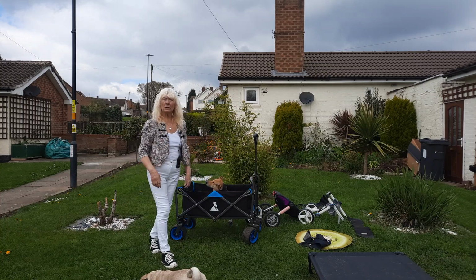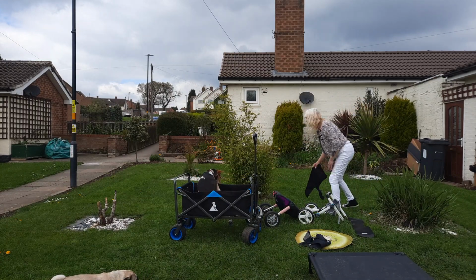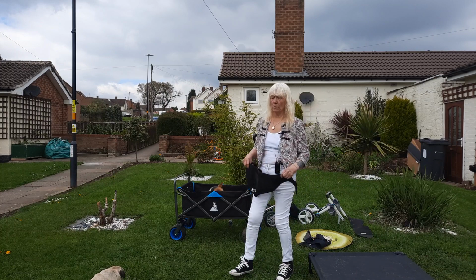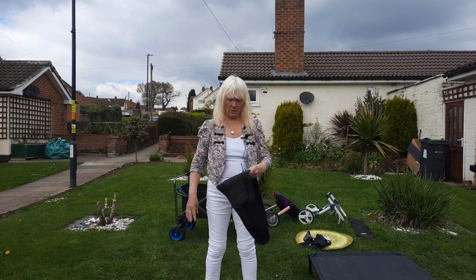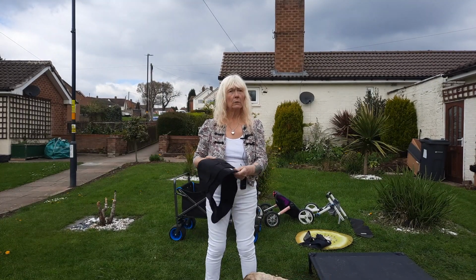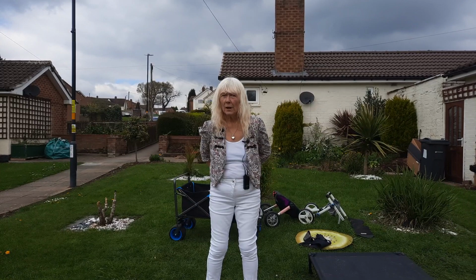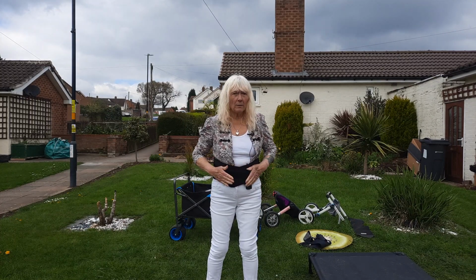Right, just get on to the next one. You've seen all these before. I just want to show you this as well. If you've got a large dog, as you'll know, if you have to pop them in wheelchairs, they can get quite heavy. So if you find that you're getting a bit of backache, what I do, I pop a nice belt on. It supports your back and you don't have to worry about going off your feet. You don't want to go off your feet because who's going to look after your dog? So I'll stick that on. There you go.